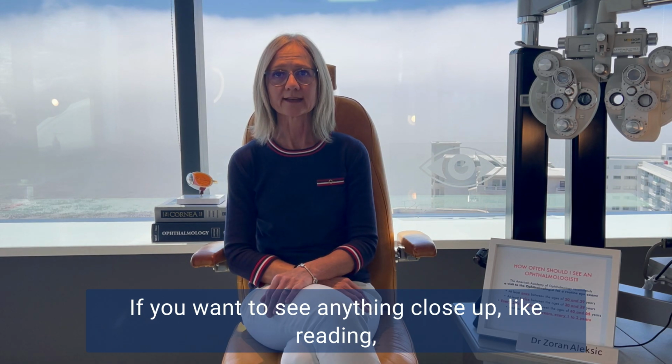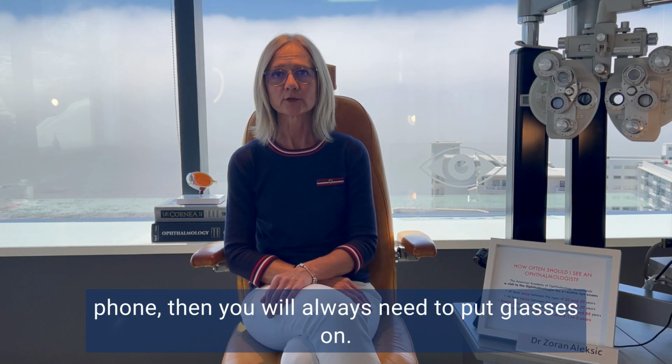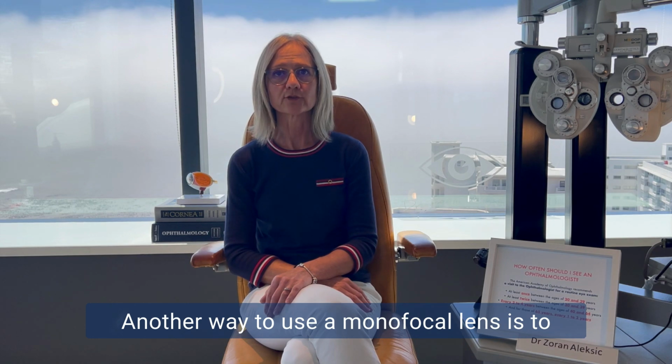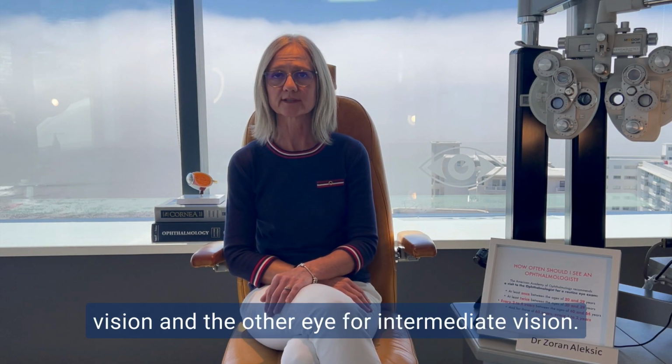If you want to see anything closer, like reading, working on the computer or laptop, looking at your cell phone, then you will always need to put glasses on. Another way to use a monofocal lens is to do monovision, where one eye is corrected for distance vision and the other eye for intermediate vision.